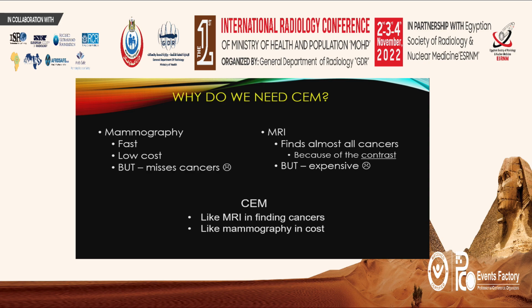Well, we know mammography is great at screening, it's fast and low cost, but it is not perfectly sensitive. MRI, on the other hand, finds almost all the cancers, and that's because it uses a contrast agent, but it's expensive. So the idea of contrast-enhanced mammography is that it would be like MRI in terms of finding cancers due to the contrast, but like mammography in terms of cost.